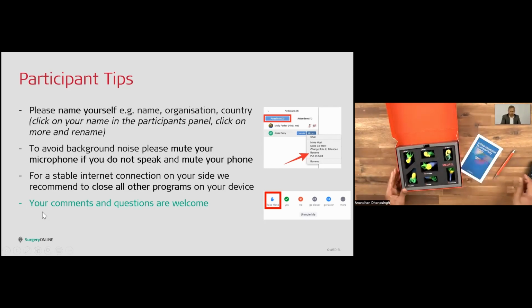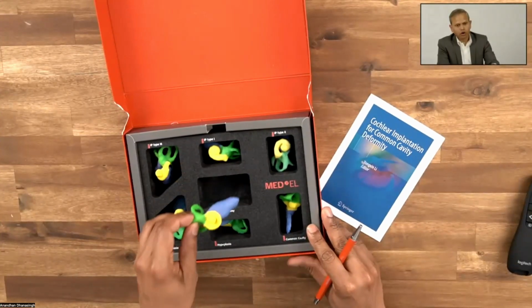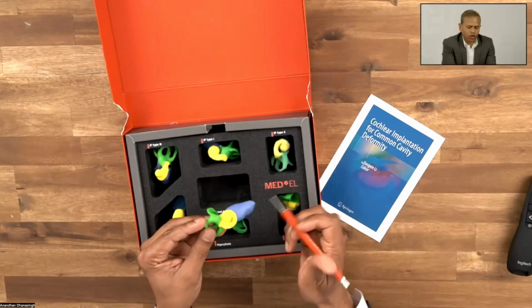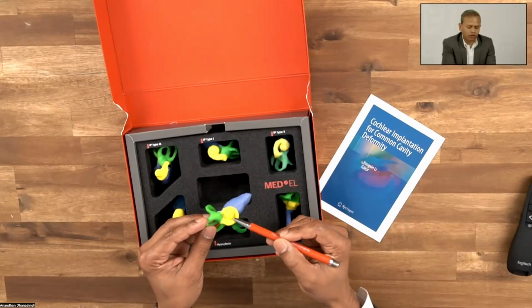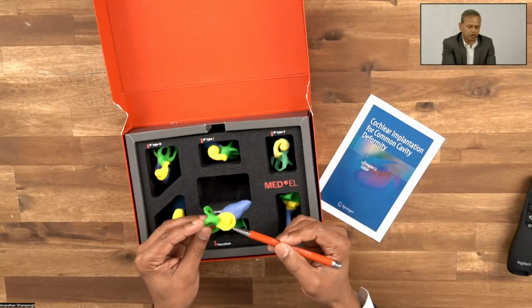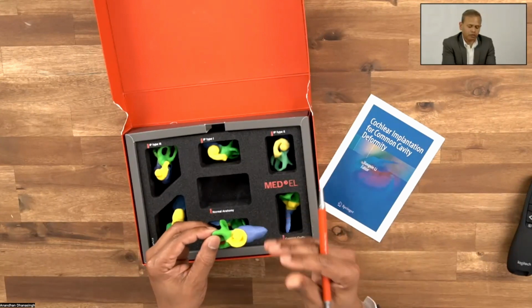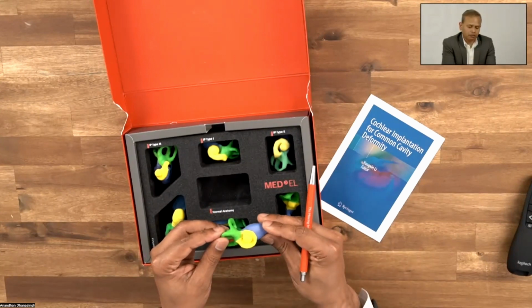Before we go on to introduce our speaker for today, let me take a few minutes to introduce what the topic is. In the normal anatomy of an ear, where the cochlear portion is very well defined, placing an electrode inside the cochlea to cover the entire frequency range is pretty straightforward following the surgical procedure.